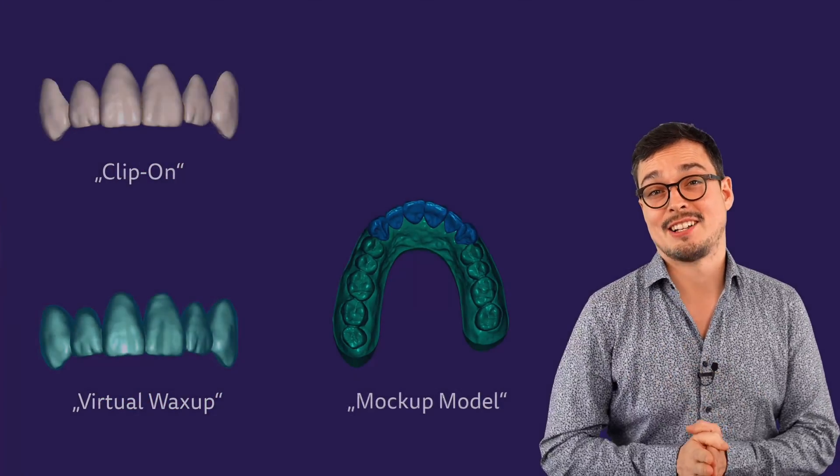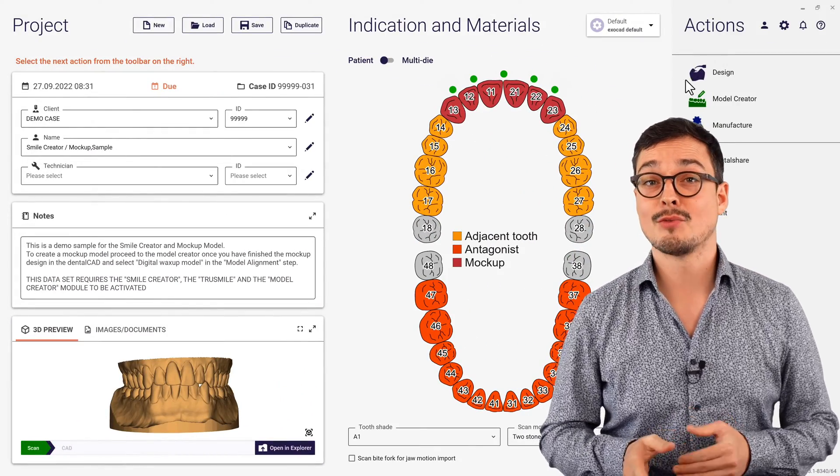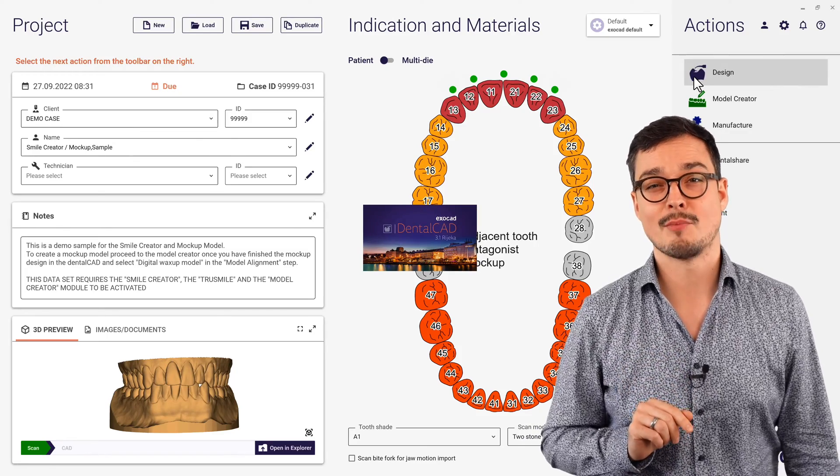Now let's start right away designing a mockup using this Smile Creator and mockup sample. Afterwards, you will get more detailed insights about advanced options and parameters.